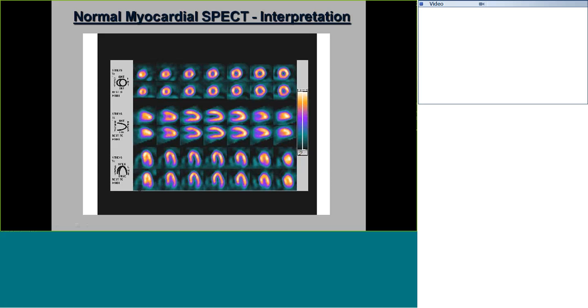So it starts from black and it ends with white. All the blackened areas are showing less myocardial perfusion, and all the pink and white are showing normal perfusion to the myocardium. So naturally you can see the left ventricular cavity shows no tracer presence. So that is the ventricular cavity. It's an absolutely normal myocardium. So you don't see any myocardial perfusion defects during stress.